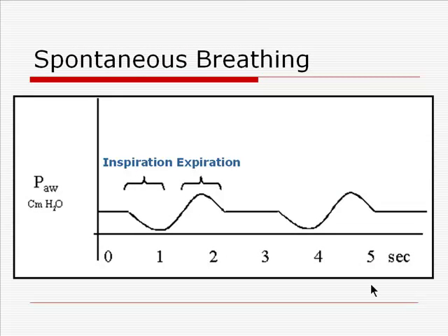In patients who are intubated and connected to a ventilator, the ventilator will measure the airway pressure in the tubing returning to the ventilator. That pressure should be equal to atmospheric pressure if the patient is not receiving PEEP, or it will equal the PEEP pressure as selected by the physician. When a patient is breathing spontaneously while intubated, inspiration will be associated with a drop in airway pressure and expiration with an increase in airway pressure.